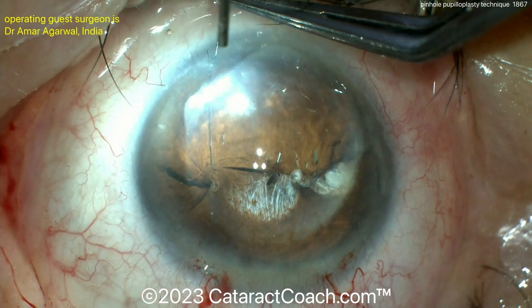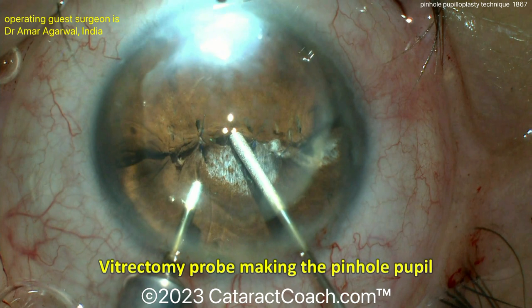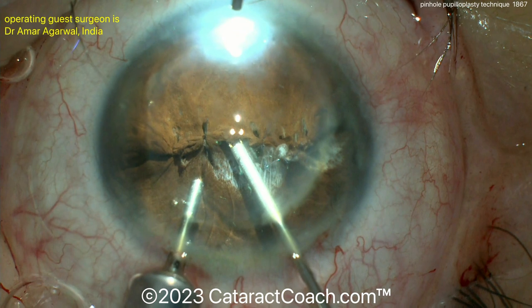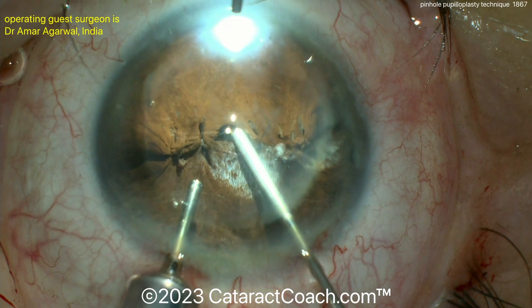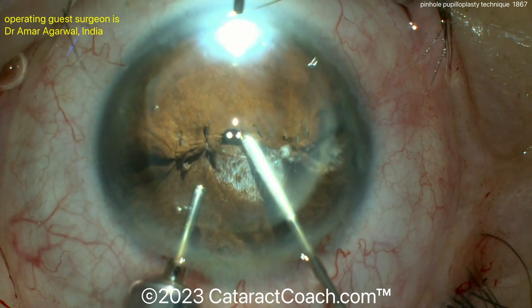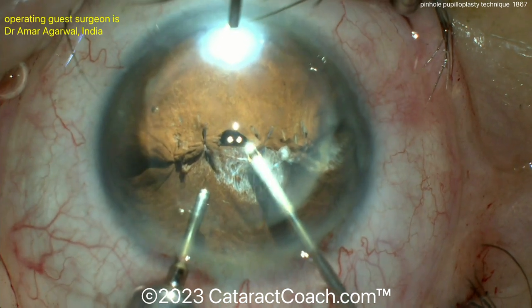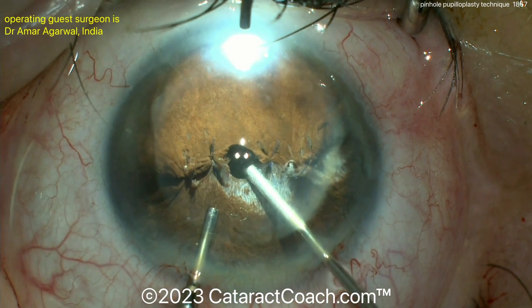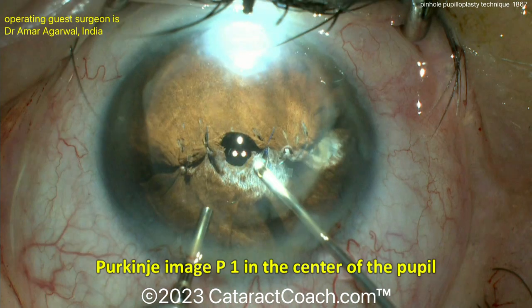Now you can see where the Purkinje light reflex is. You can use the vitrectomy probe to make that central pinhole the exact size that you want — in this case, about one and a half millimeters. You're going to get that centered up using the Purkinje light reflexes. Use a very low cut rate and take your time. You can make a good pupil opening — there's half of it, here's the other half. That looks beautiful, and no stray light is getting inside the eye because of that small pupil effect. Notice that Purkinje P1 image right in the center of the pupil.